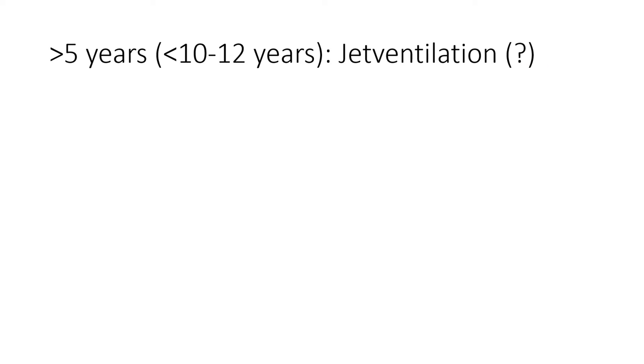And this is, again, controversial. I think the Difficult Airway Society is against this, because there is a high risk of barotrauma. There's a risk of you not getting into the airway, and then you blowing air into the subcutaneous tissue. But this is a desperate situation.